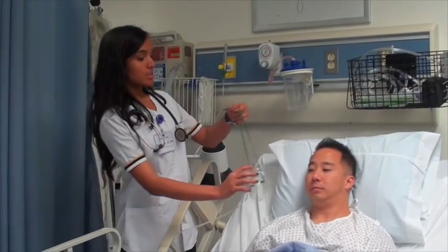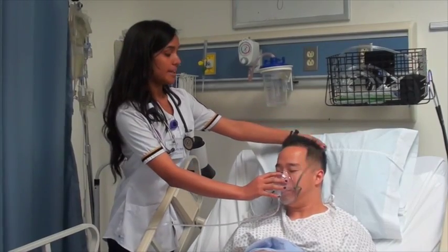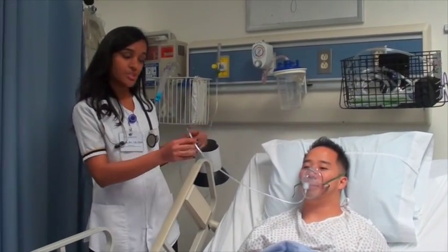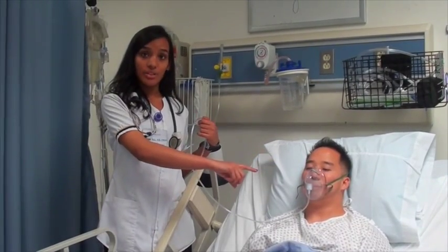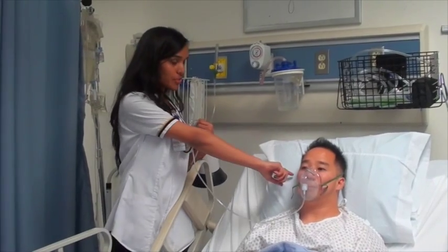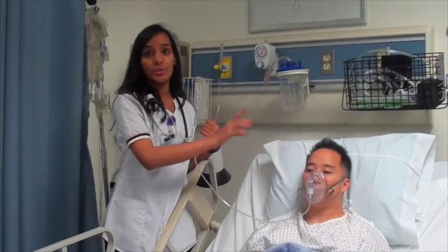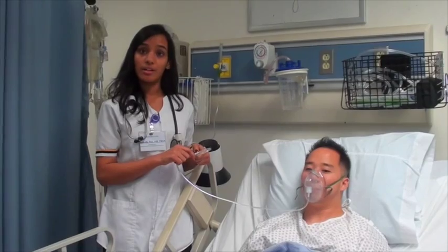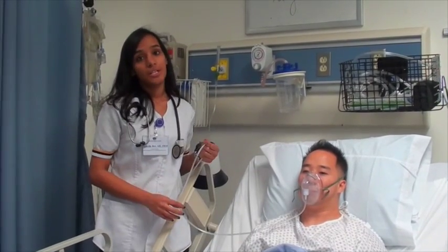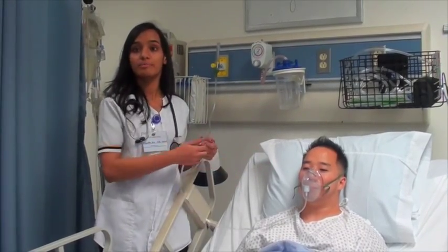It consists of a plastic face mask that fits snugly over the nose and mouth, and an elastic strap that goes over the head. It has tubing that connects to the oxygen source. As a nurse, you should wash and dry the mask every 2 hours. Watch for pressure necrosis, and to prevent it, consider using padding. You should also switch to the nasal cannula when the patient is eating, and consider humidification to prevent the nasal mucosa from drying.